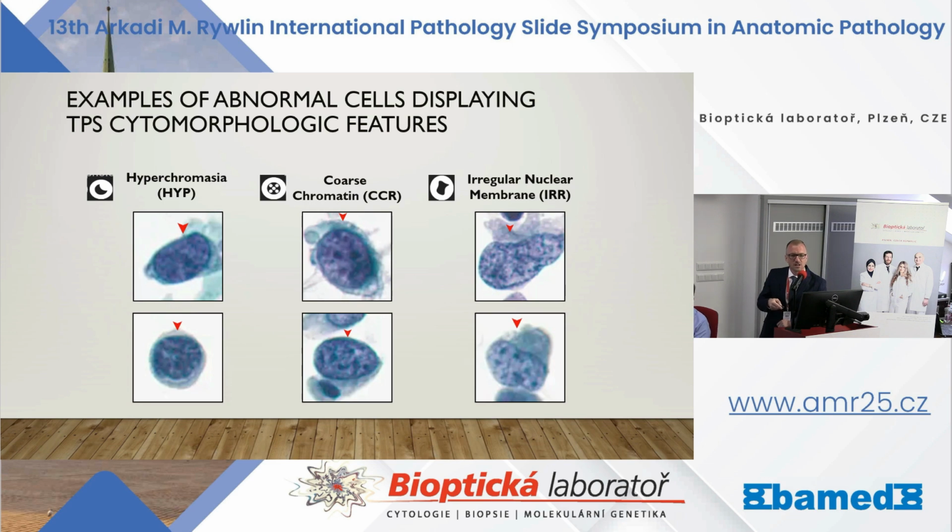It works like just a really nice cytology technician which looks over the slide, makes some points, shows the slide to you, and says, look at those cells, these are really, really bad, and you really can't just exclude all the other slide. You have to look for everything.